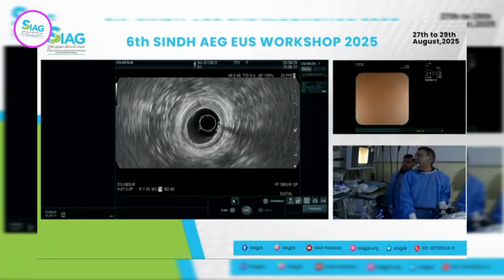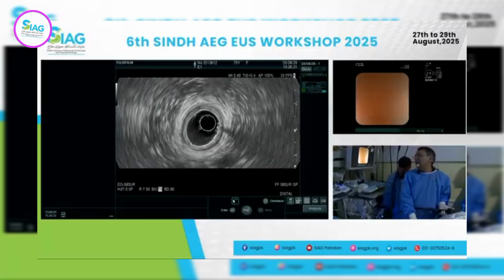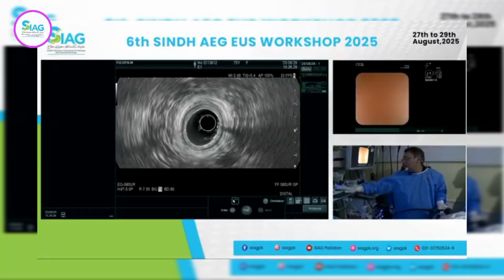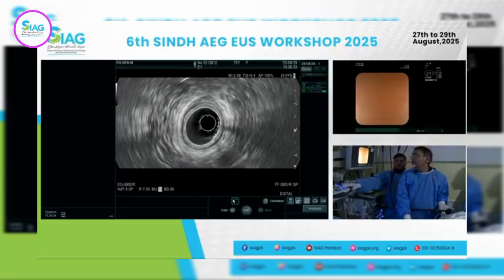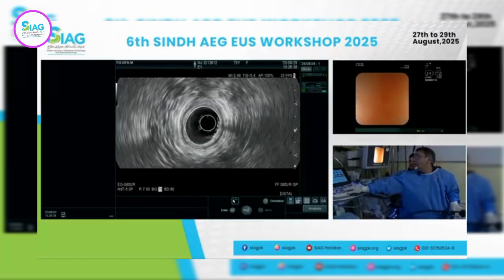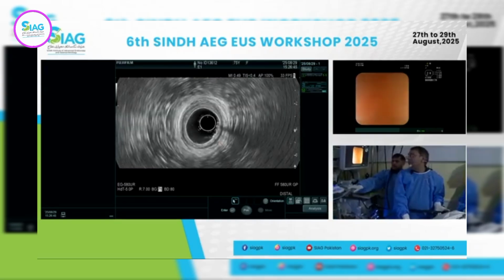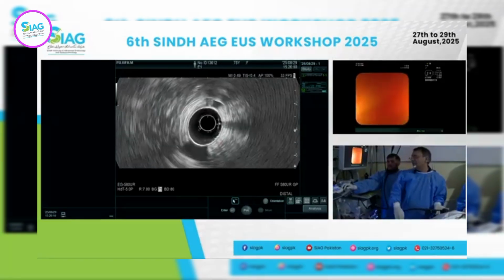So you pay attention to that muscularis propria, internal sphincter. You're going to see that as soon as we come close to the distal anal canal, it becomes a little bit fuzzy and mixes with that hyperechogenic area. I'll freeze this image, right in this area. Pay attention right here. There's going to be another kind of ring area. You see this area? This one right there, that is the external sphincter. And they both mingle with each other and it becomes a bit more fuzzy when we get out. Right there, that's the external sphincter.